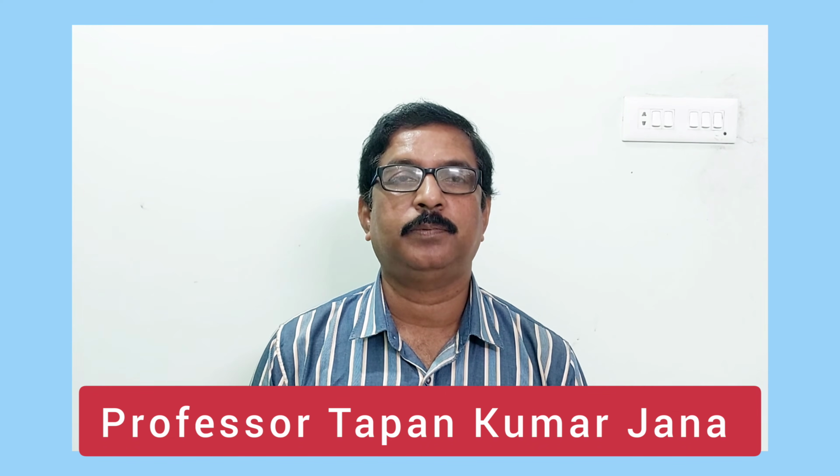Good evening, students. Today I will discuss one of the important parts of the oral and practical examination, and that one is the radiology part. In radiology, today I will discuss some of the X-rays of the head and neck region.